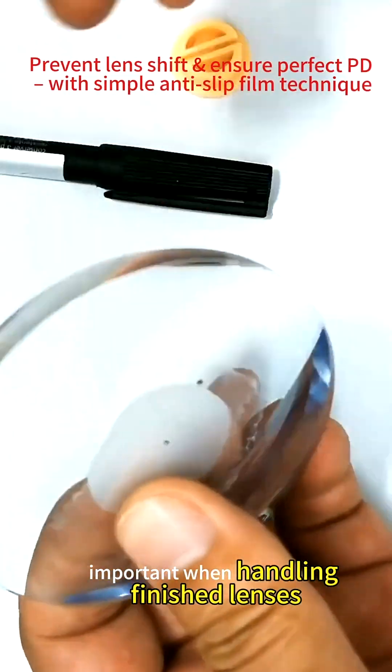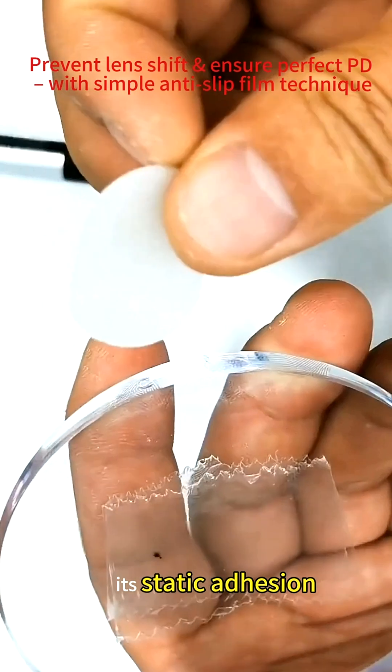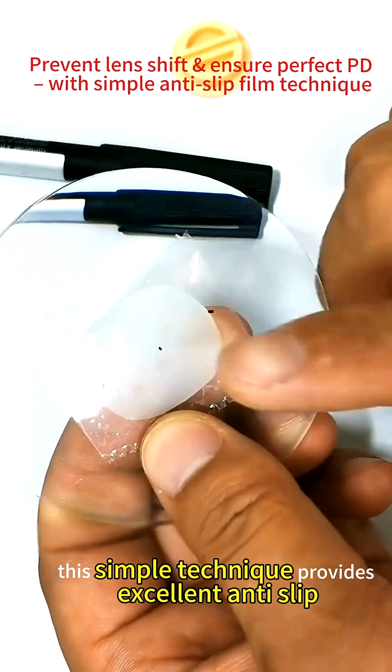Important when handling finished lenses: support the edges firmly to prevent dropping. It's static adhesion — no actual adhesive is used. This simple technique provides excellent anti-slip performance.